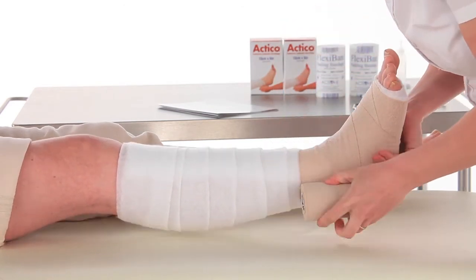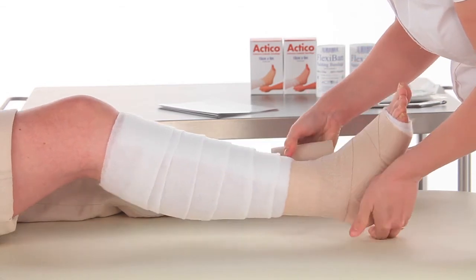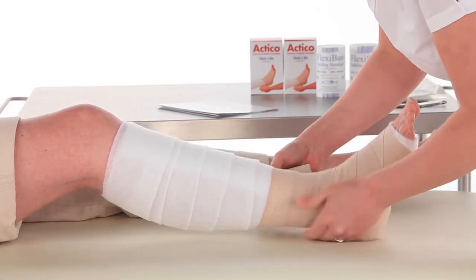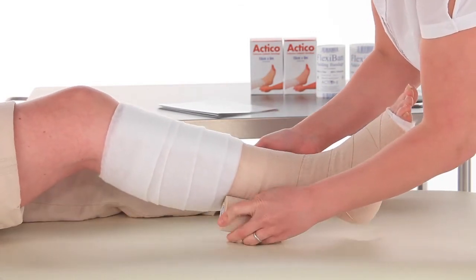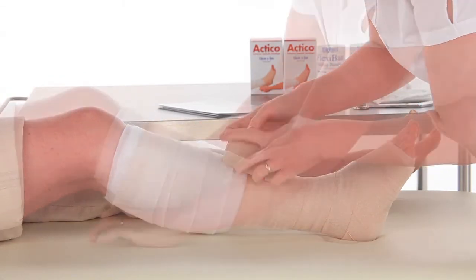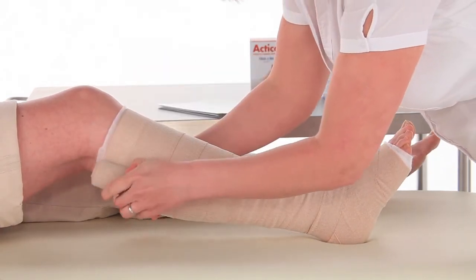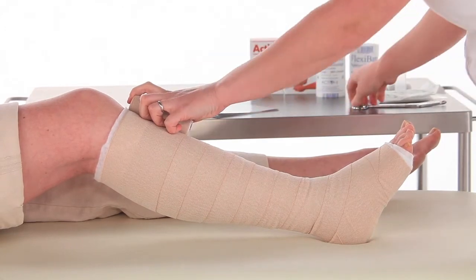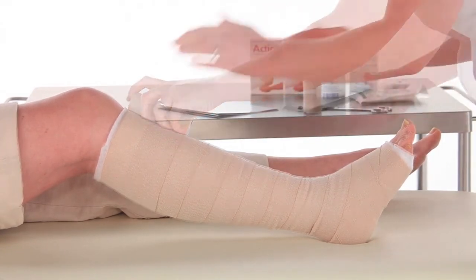Start to spiral up the leg using the lock and roll method, 50% overlap and at full stretch. Roll the Actico round the back of the leg whilst ensuring it is locked out at full stretch. Continue with the lock and roll method up the limb in a spiral. Finish the Actico three centimetres below the popliteal fossa. Cut off excess bandage and tape if necessary. Ensure layers are bonded.